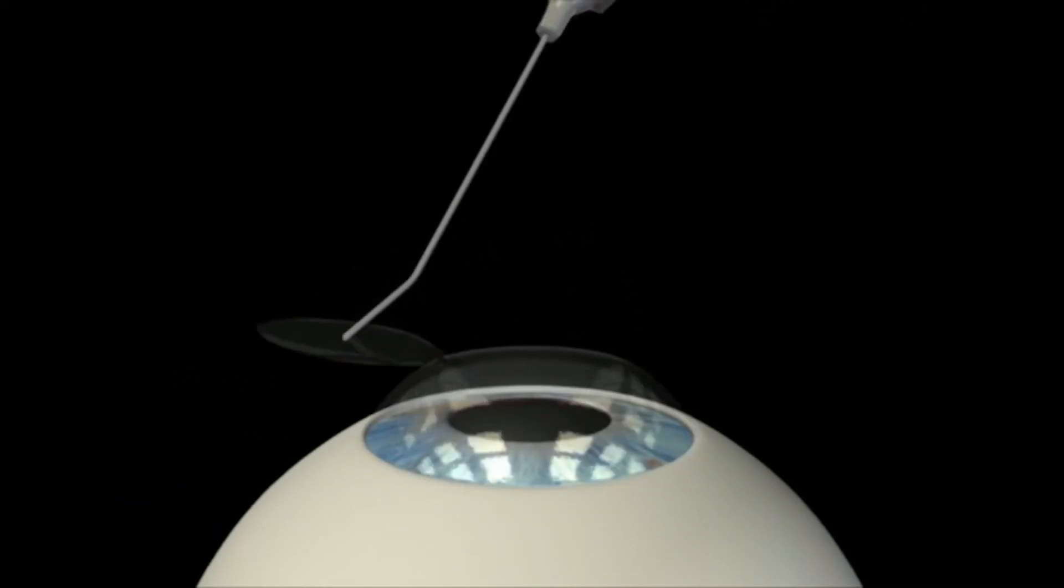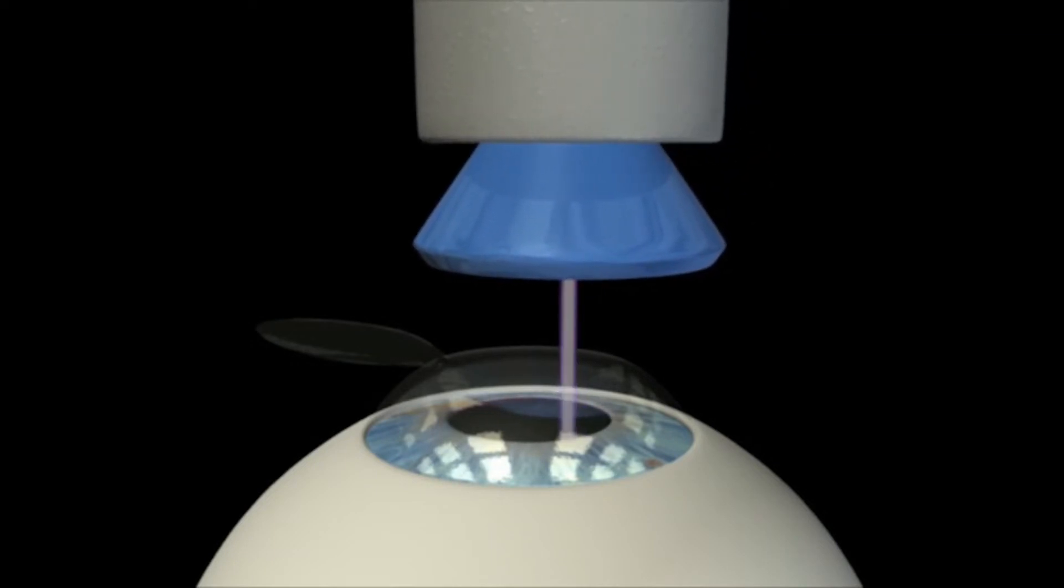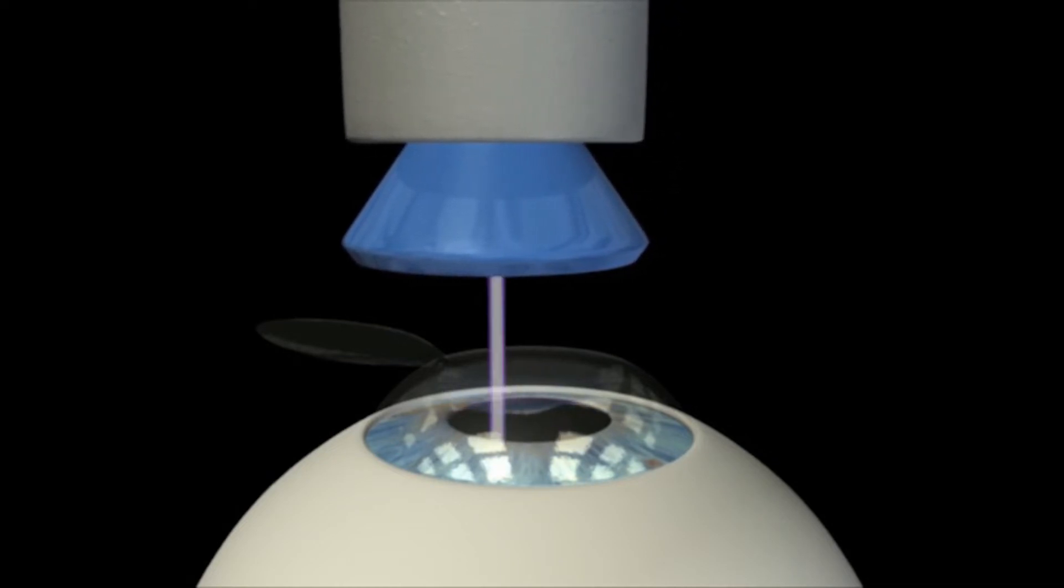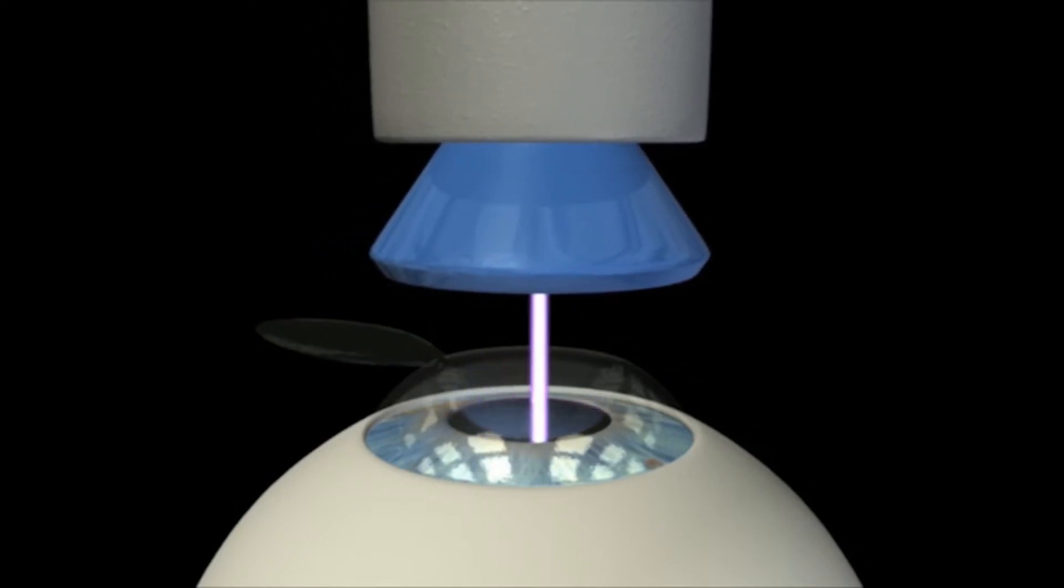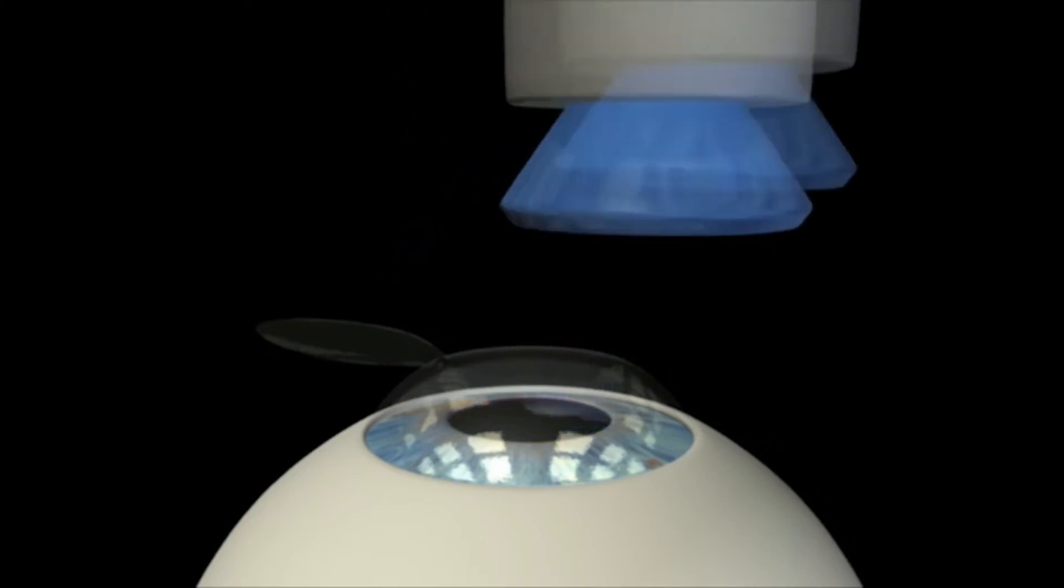Using a special instrument, the flap is folded back so that the excimer laser can reshape your cornea. The excimer laser uses a cool ultraviolet light beam to remove small bits of your cornea and reshape it. This process is done with small laser pulses controlled by a computer. The pulses are based on measurements taken by your doctor in a pre-operation exam.